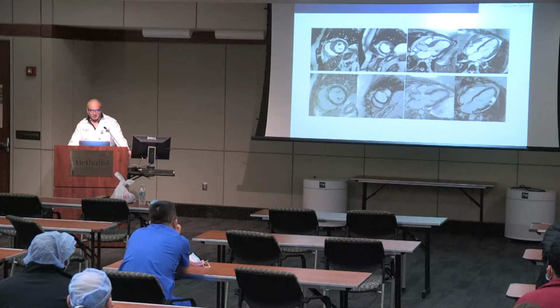So there is dense, almost transmural scar in the hypertrophied septum. So this is in the lateral wall. Okay. And also in the septum. What about the RV area? And in the RV as well, yeah.